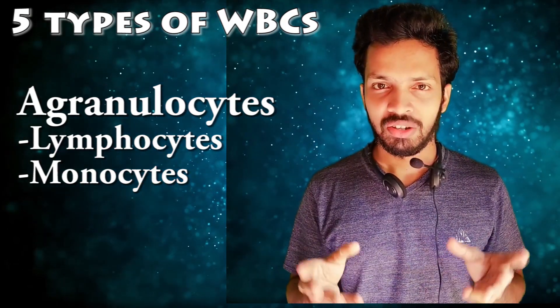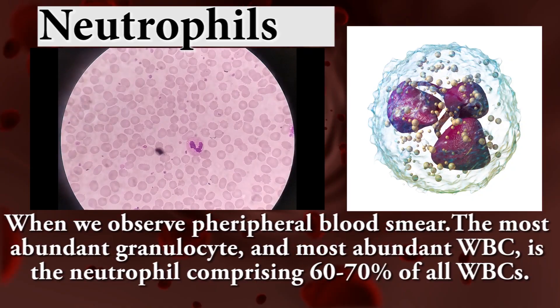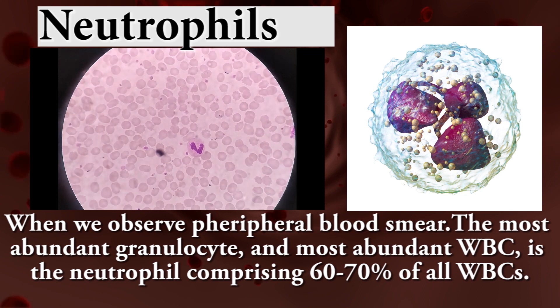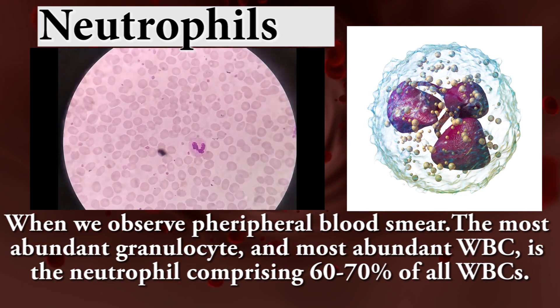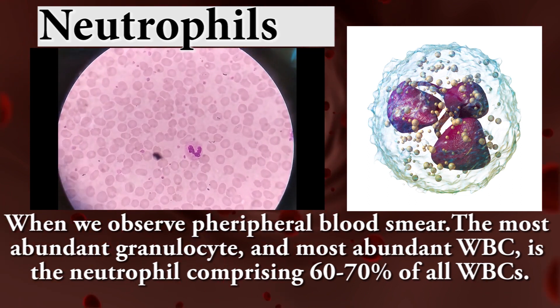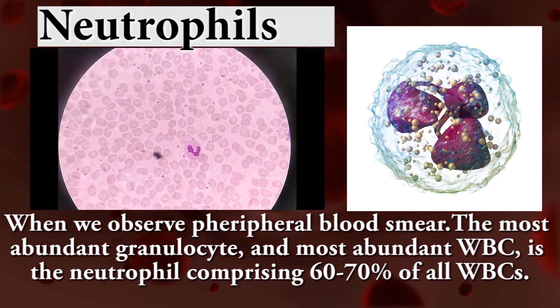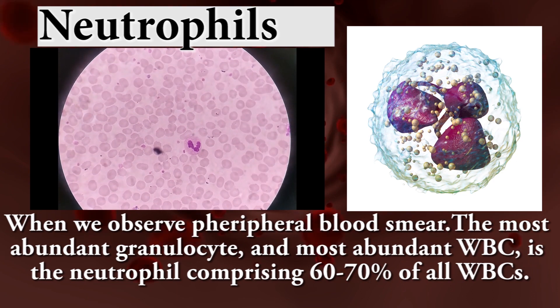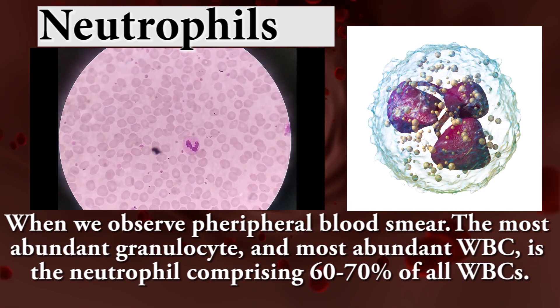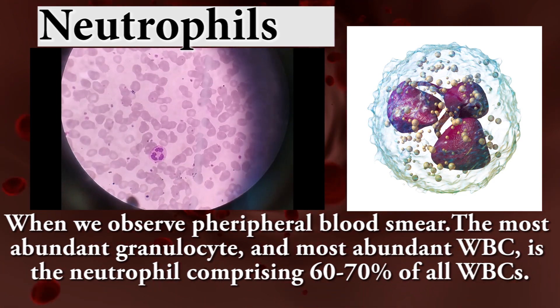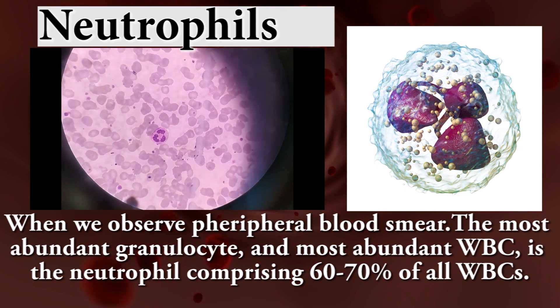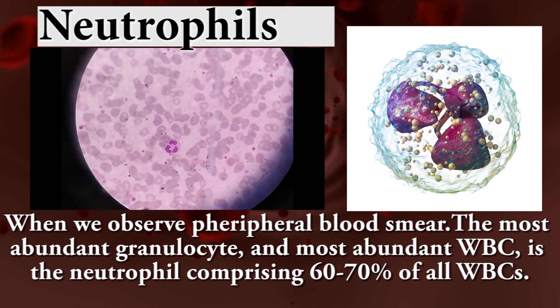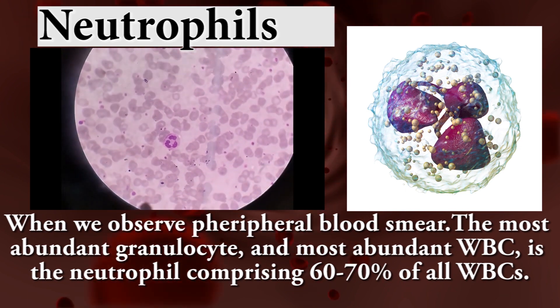Let's see one by one. Neutrophils — when we observe peripheral blood smear, the most abundant granulocyte and most abundant WBC is the neutrophil, comprising 60 to 70% of all WBCs.